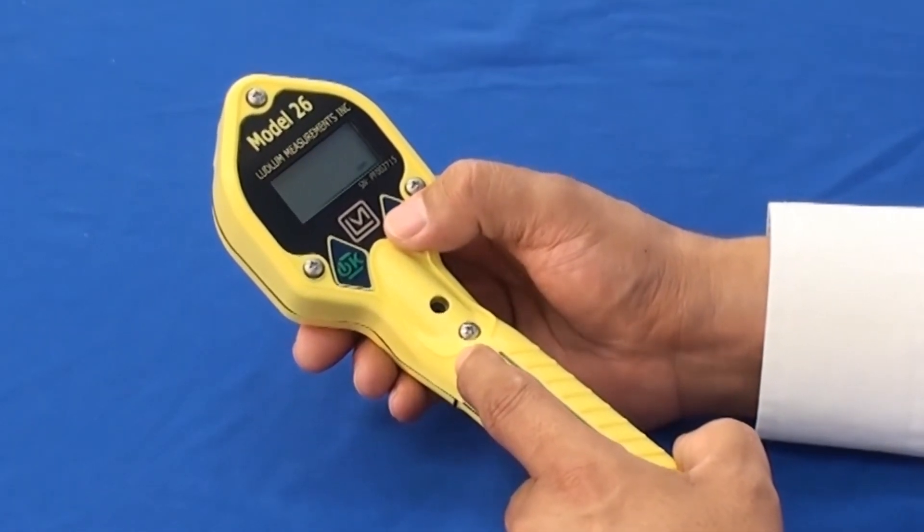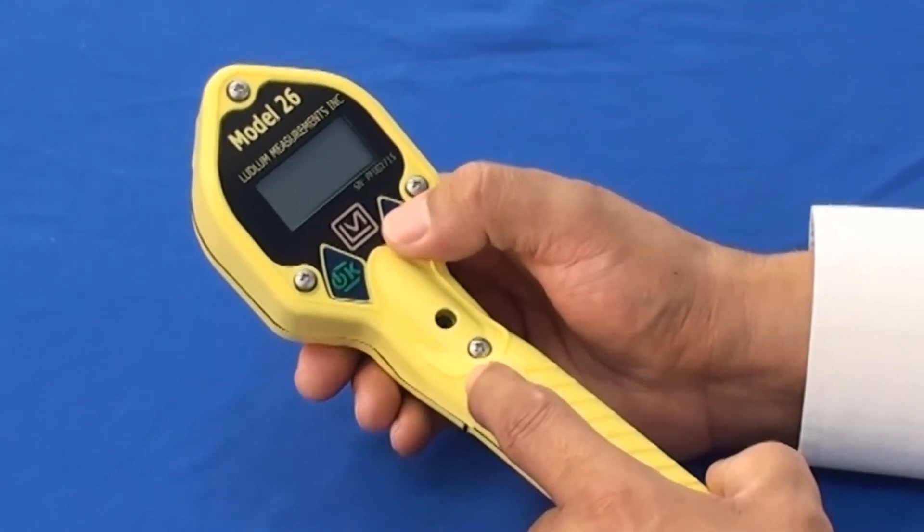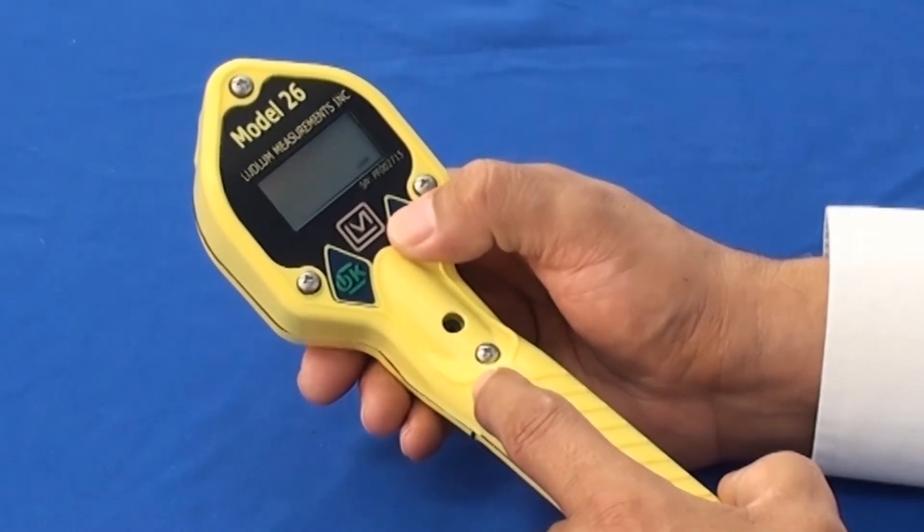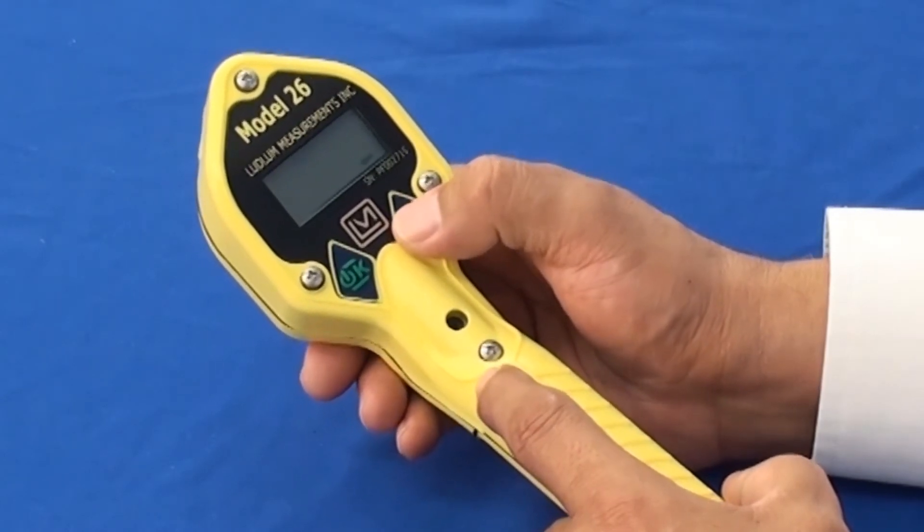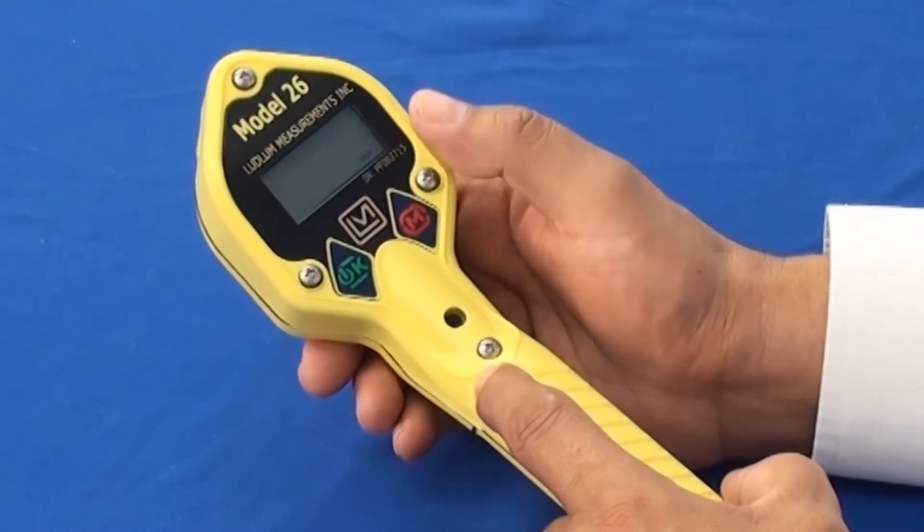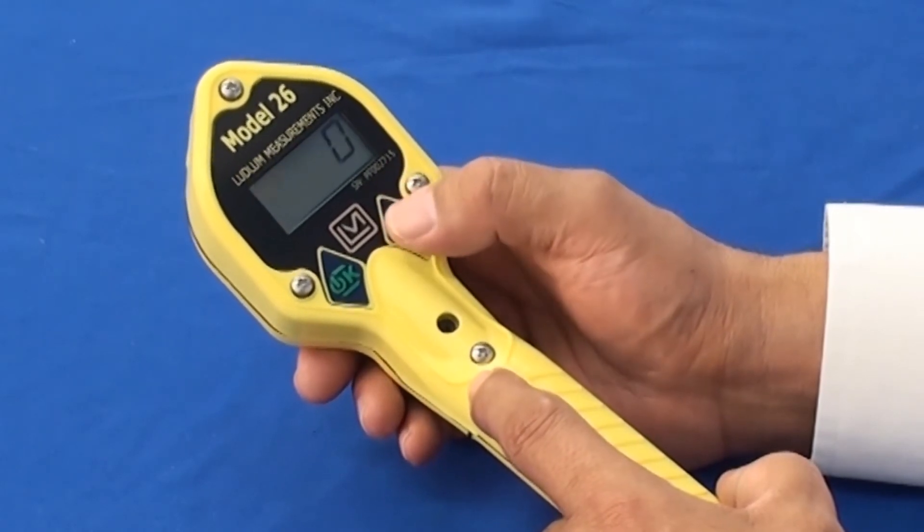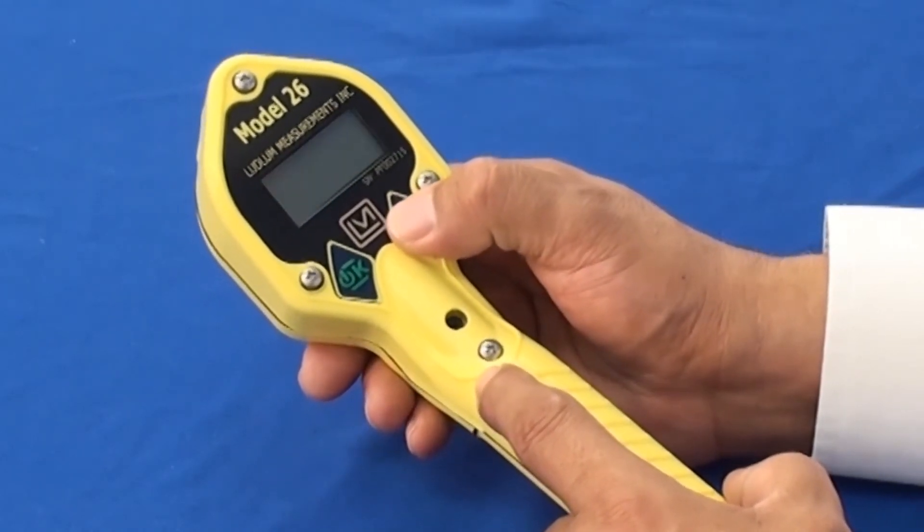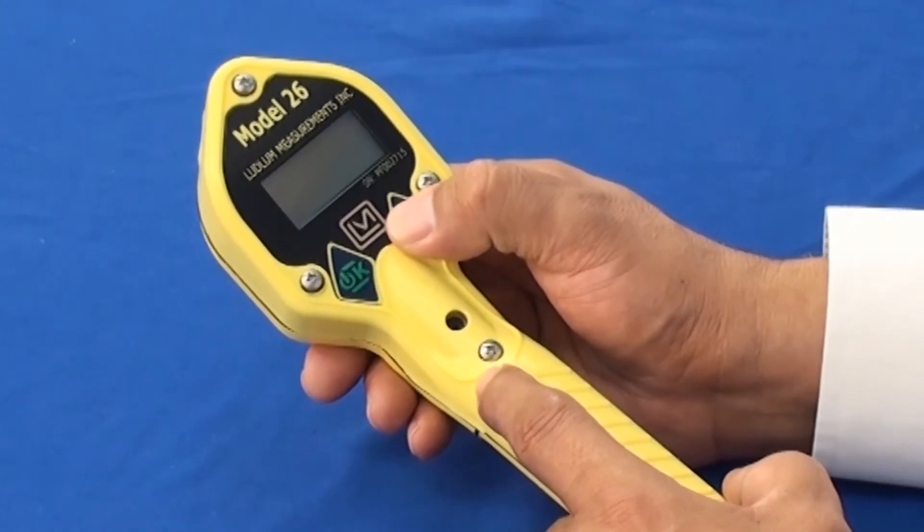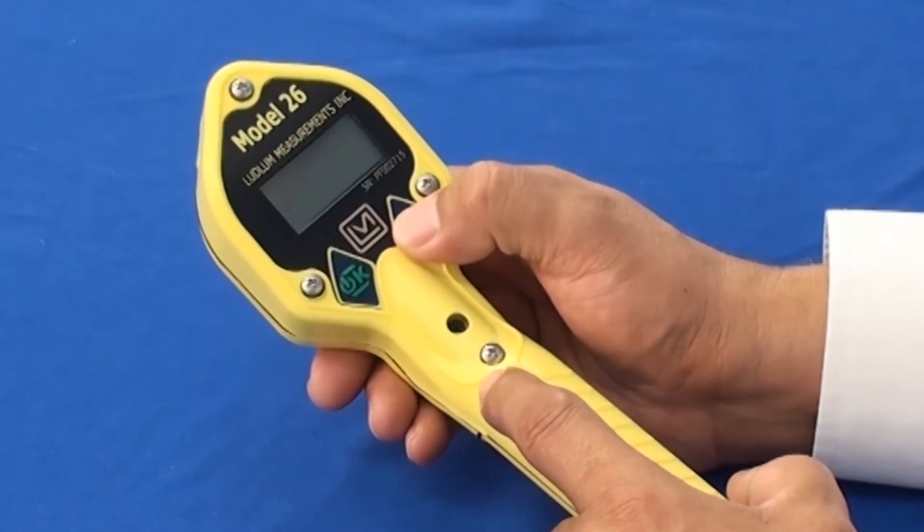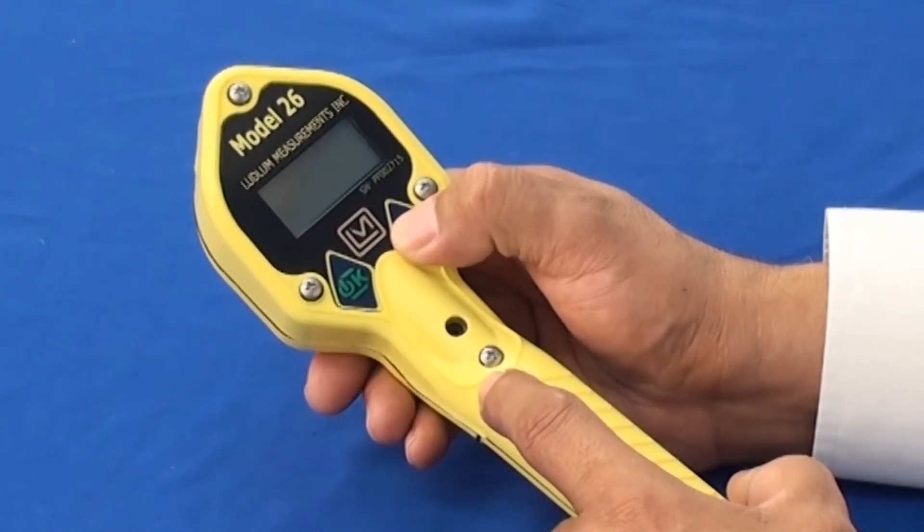In the setup mode, beginning with the type of count rate, whether it be counts per second or counts per minute, you would select one of the two. And then following into the second display, which is your response time, you would use the Acknowledge button to change the value from zero to nine.